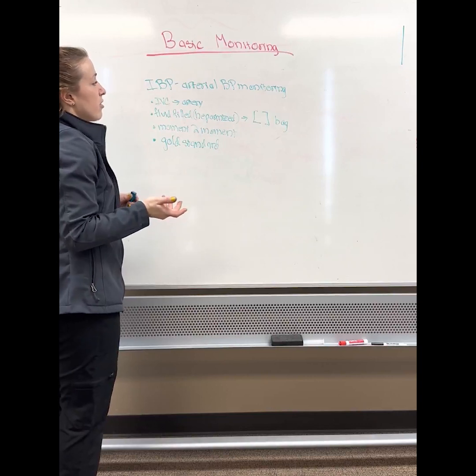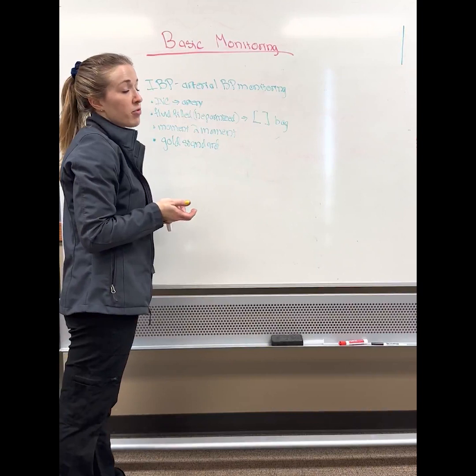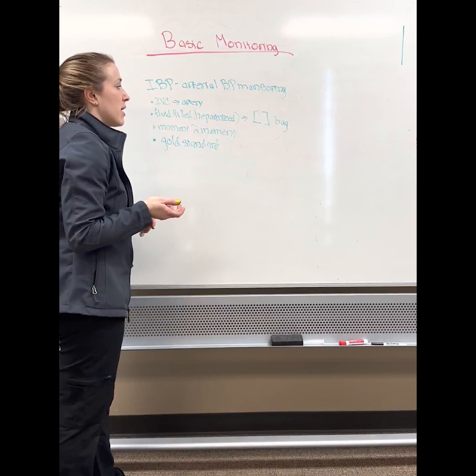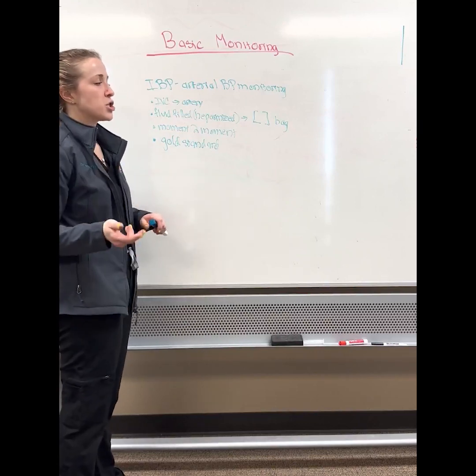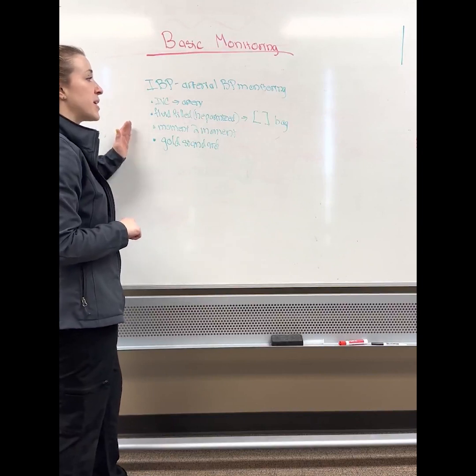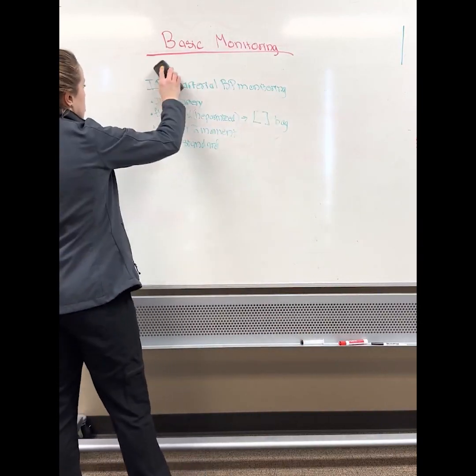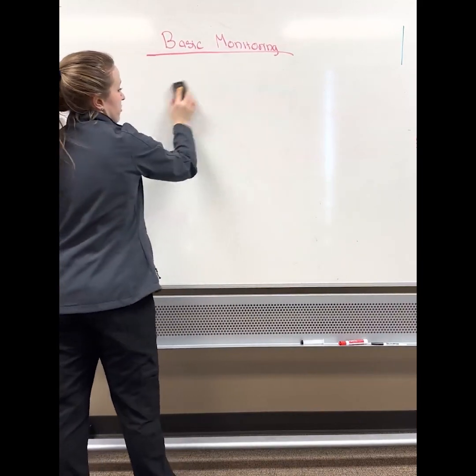The other nice thing about having an artery cannulated is that you can pull a blood sample very easily. It's pulsatile, so it fills on its own, and it's a very easy way to check blood glucose, electrolytes, or oxygen if you have a problem with your patient. So think of it not only as a way to monitor, but as a way to sample. That's what I can say about invasive blood pressure monitoring. We'll talk in later sessions about how to fix things like low blood pressure or arrhythmias, but it's beyond the scope of today's talk.